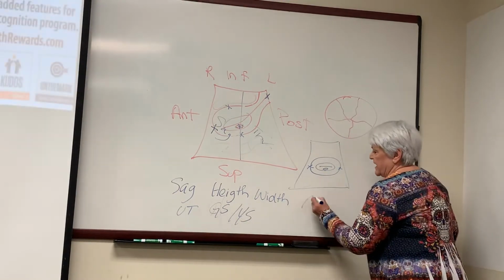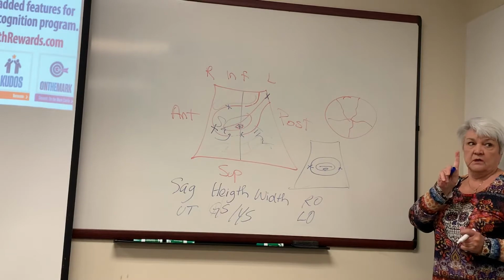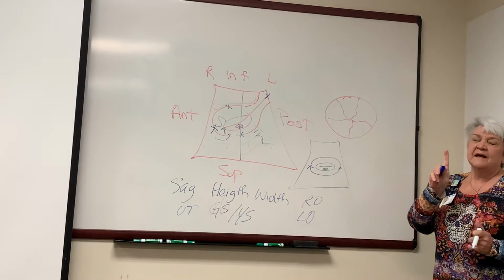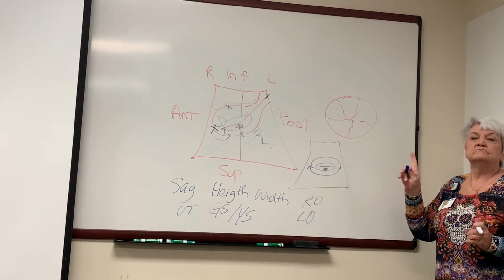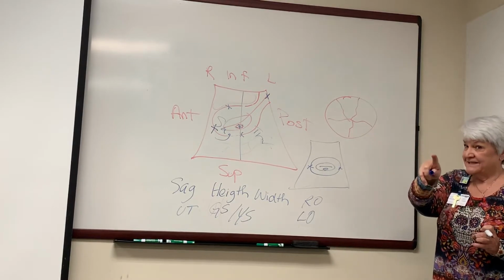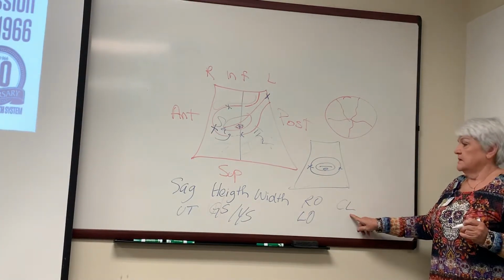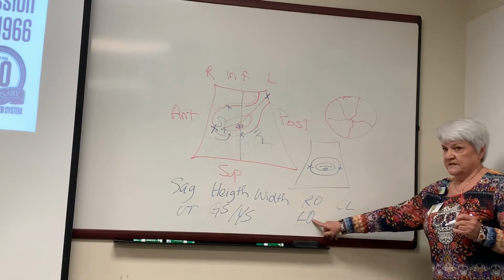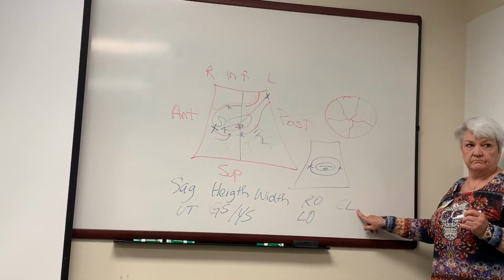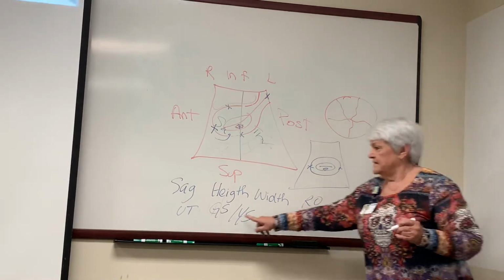I'm going to do my right ovary. I'm going to do my left ovary. But then there's going to be one more thing that we're going to look at. And what is that? Or adnexa? Yeah, but we're on the ovaries right now. What is it? Nope. You're close. The corpus luteum. Okay? The corpus luteum. So this is 3 measurements, with and without color.